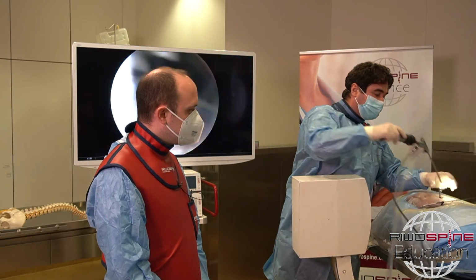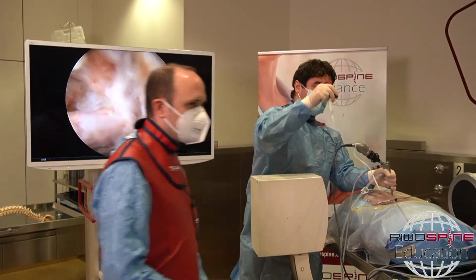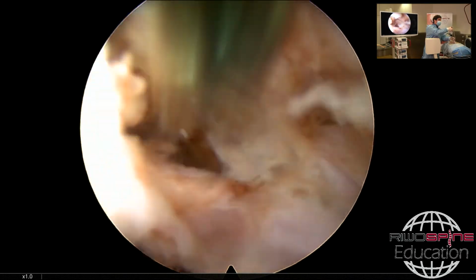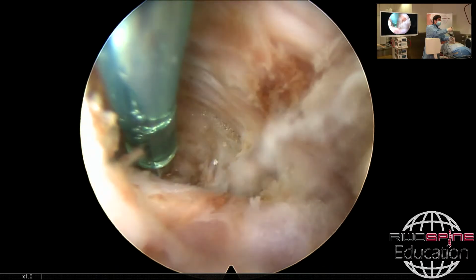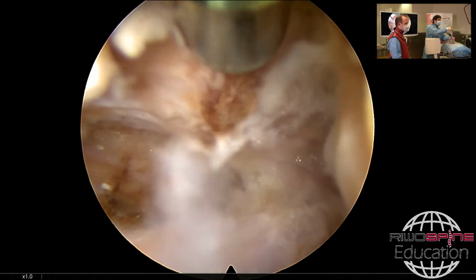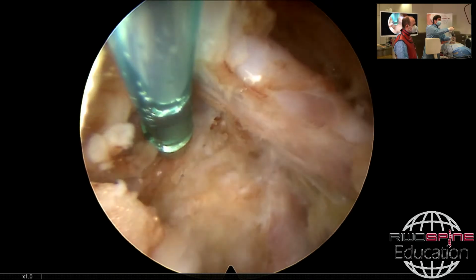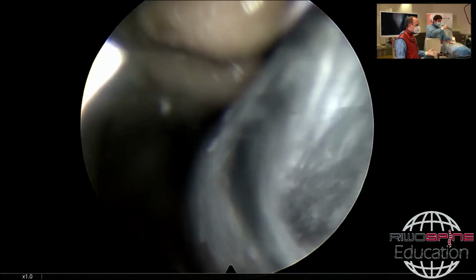Maybe I can show you, especially if you work with the axilla. As you know, there are a lot of vessels located in the axilla, and you have to coagulate them like that. Really, you can use your radioablator bipolar and like this stop all the bleedings from here. Sometimes you see, especially on the dura, it's bleeding, and then with one shot very close, just on the dura, you can stop all the bleedings. You can do this only with the 4 megahertz radioablator. Thank you. I think the question was answered.